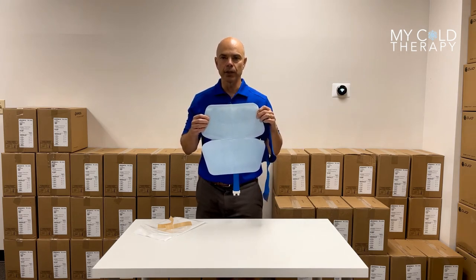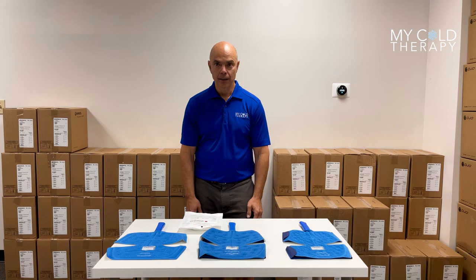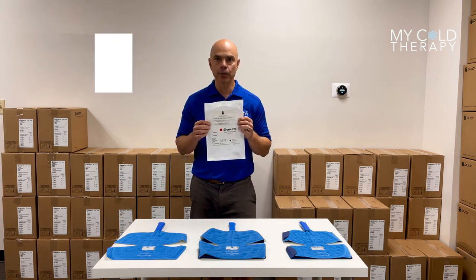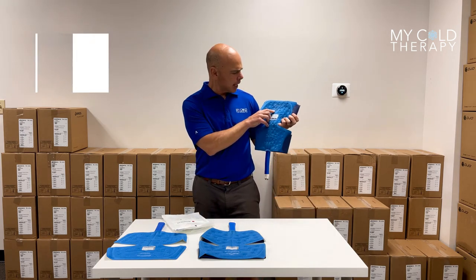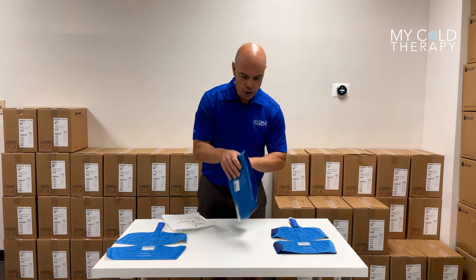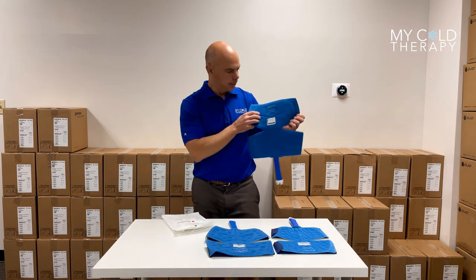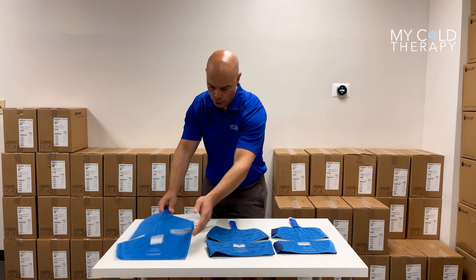Now we're going to go over the different types of sterile pads that Bregg offers for the Polacare Cube. The Polar dressing for the knee, part number 04708, fits three different pads for the Polacare Cube. The first one it fits is the regular knee pad, part number 04700. It also fits the large knee pad, which is 04703, and it also fits the hip pad, part number 04750. This sterile pad works on all three of these.